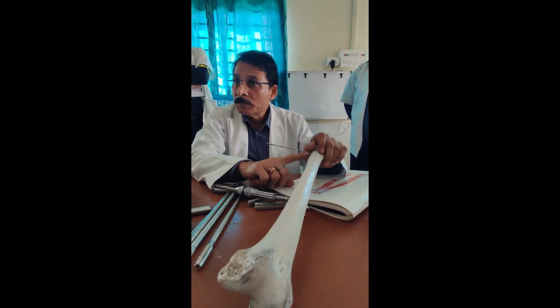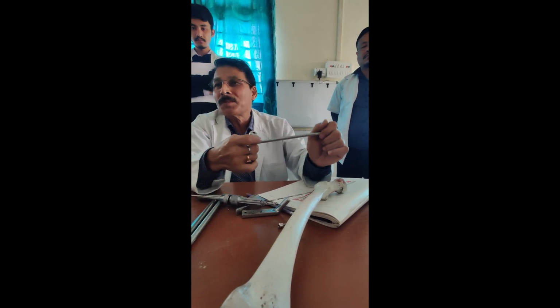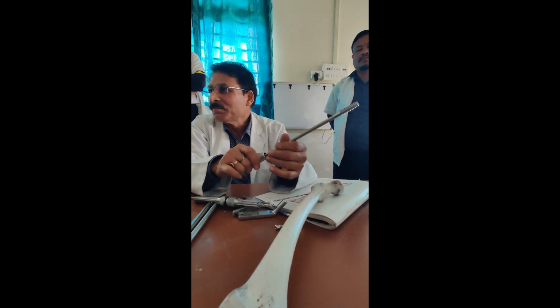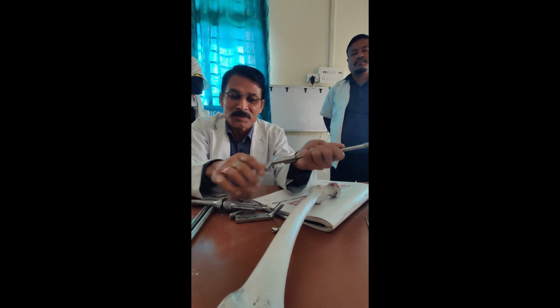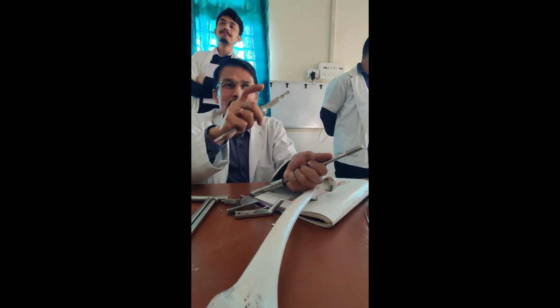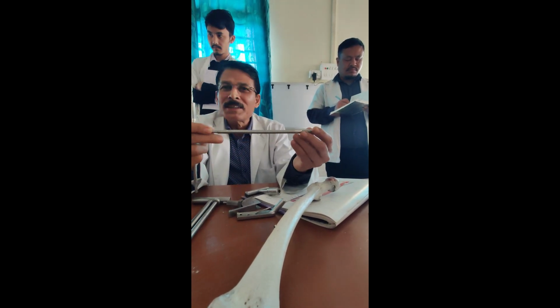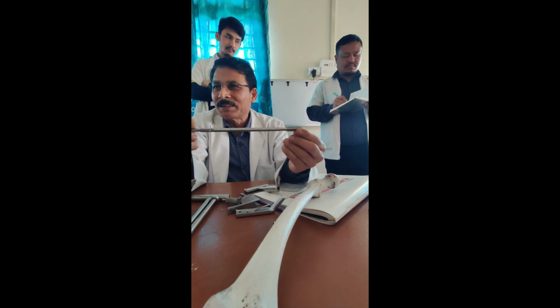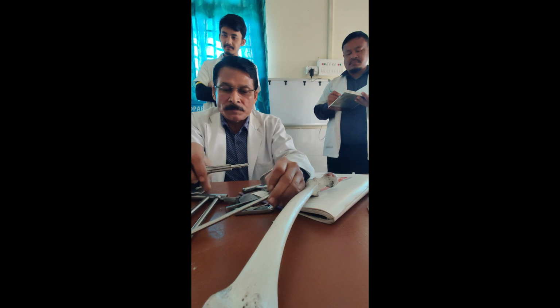Now what is my next job? This reaming is done. Now is tapping. Now in the tapping process, two things come up. One is very osteoporotic bone. There is no point in tapping in very osteoporotic bone. While doing it, how do you know the patient has very osteoporotic bone? While doing this, you will feel how much resistance there is. If you are feeling too much resistance, you know the bone is very strong. But if it is going in very easily, you know the bone is very soft. So if it is soft bone, I believe there is no point in doing the tapping. But in case of strong bone, you are supposed to do the tapping. Why tapping is important, I will tell you.